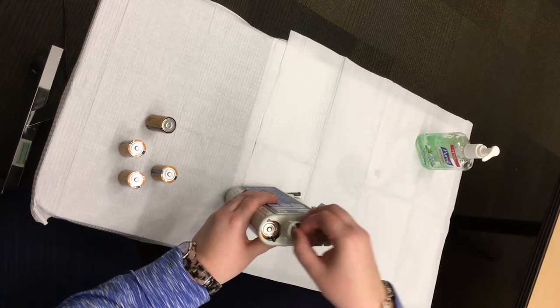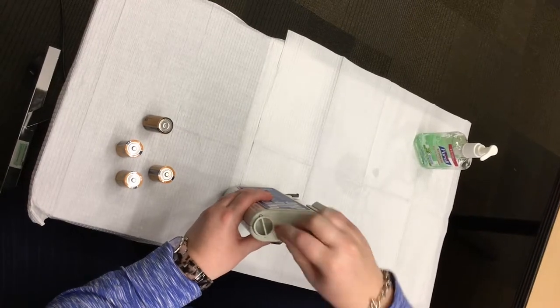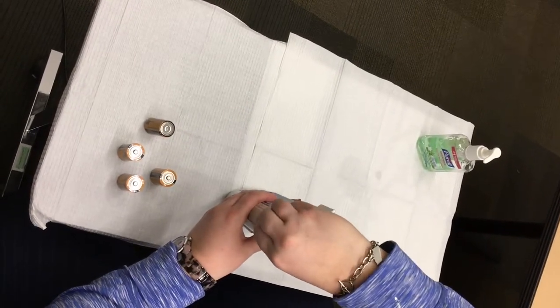Replace the screw cap by lining up the pins in the screw cap with the grooves in the pump. Push in and turn clockwise until you hear a soft click.